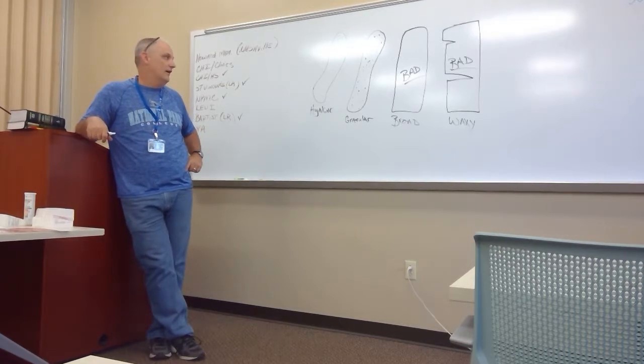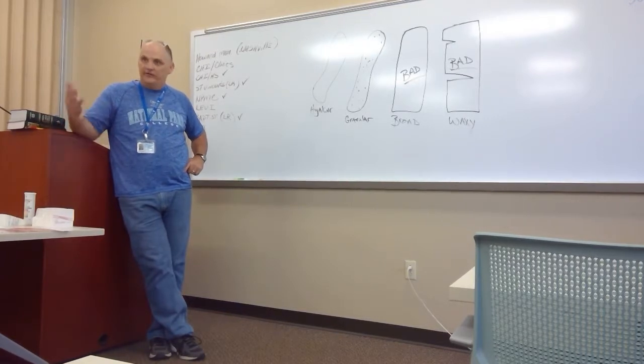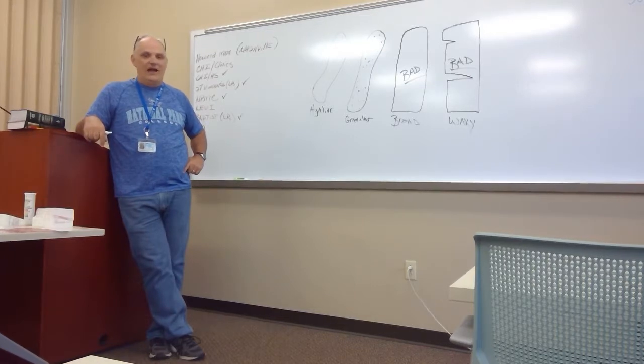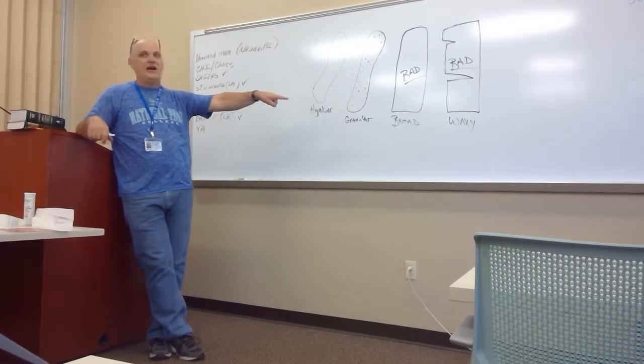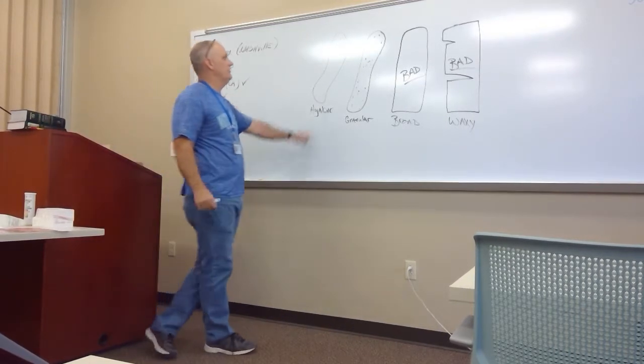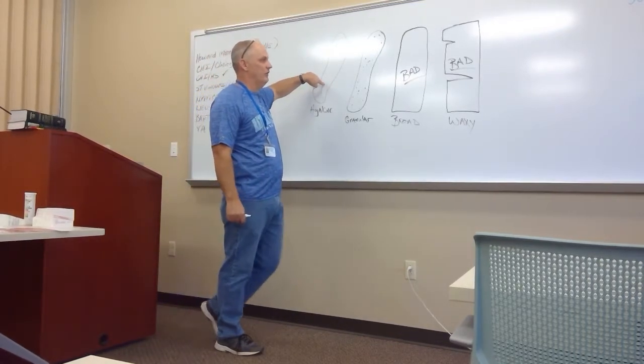No, it's me. Okay, so hyaline, granular, broad, and waxy. But again, when you read over this in your book, I'm leaving out a lot of stuff. Again, all those cellular casts and things, I think they even have bacterial casts where they're loaded with bacteria in your book. So I want you to know the 4 types. I want you to know that these are normal. You're gonna see these a lot. You'll see these at clinicals.